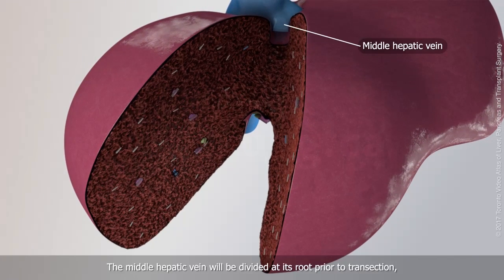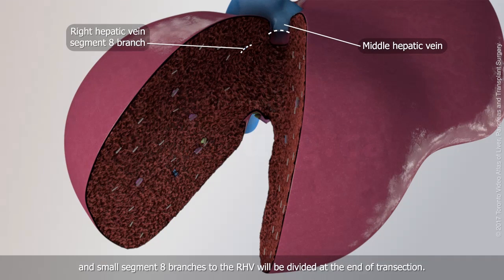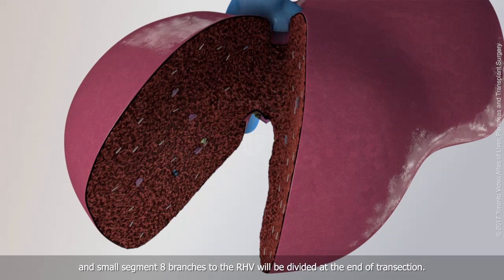The middle hepatic vein will be divided at its root prior to transection, and small segment 8 branches from the right hepatic vein will be divided at the end of transection.